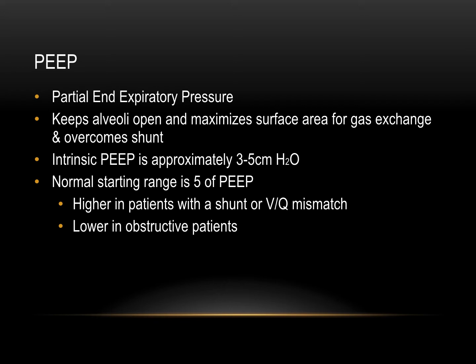We've got greater surface area. Now gas can exchange through that, as opposed to when it was just fluid; gas doesn't exchange well through that. So we add PEEP, increase the surface area, allow gas exchange to happen. So think of PEEP as oxygenation.